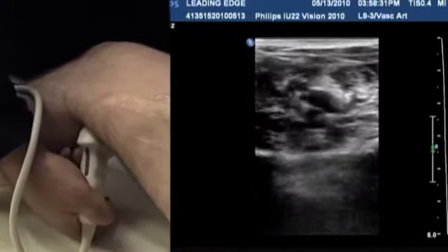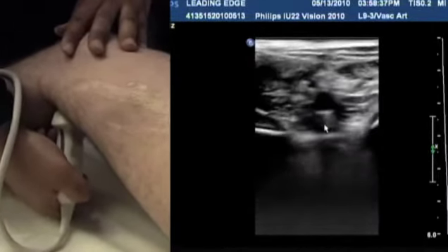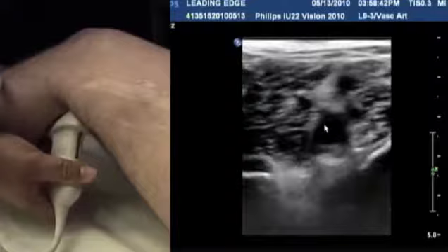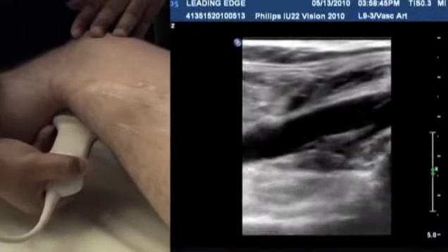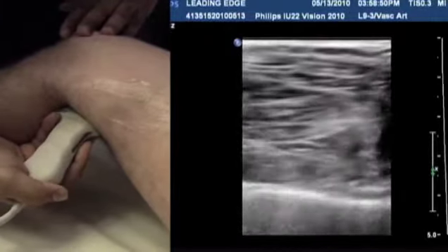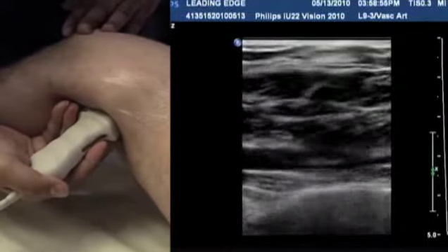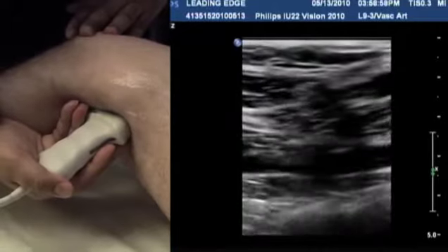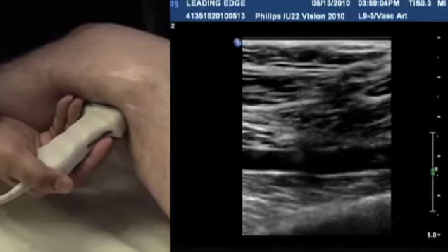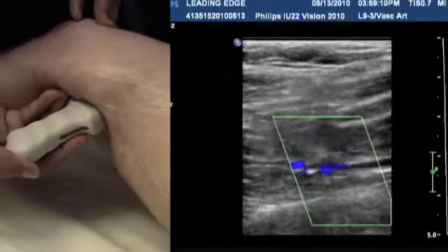And so what you're looking at here is popliteal vein and artery. There's the vein, it's just disappeared when I push down. And here's the artery. What I'll do is turn long axis now, and from the back of the leg, work my way back up proximally. Posterior approach. Here's my popliteal artery. And you can see here now that I've overlapped both of those areas from both the medial approach and a posterior approach. I'll put the color on and optimize that image.